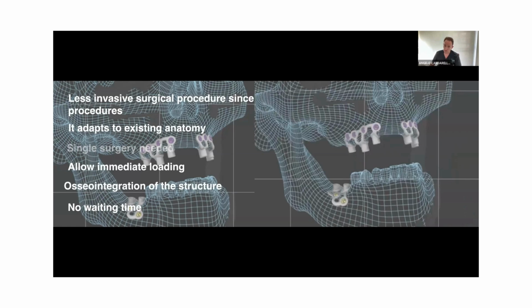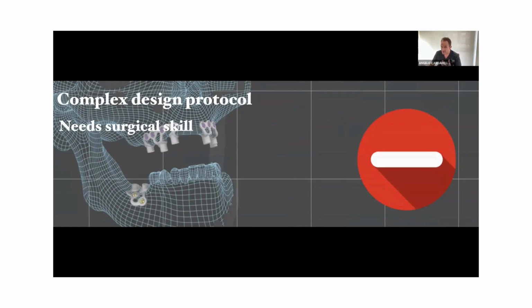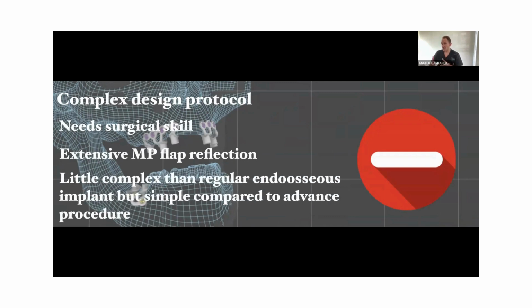in order to rehabilitate our patient. For sure, for the beginners, it's something challenging. What I mean, we need to have some experience in the surgical field. We need to have some experience in terms of the flap design procedure, because sometimes we need to open more in order to see the bone, and we need to understand how we can use some anatomical structure.